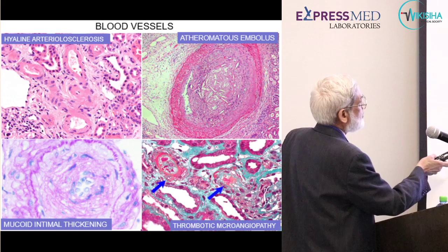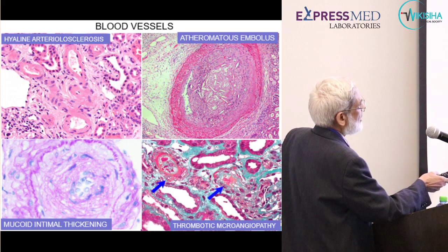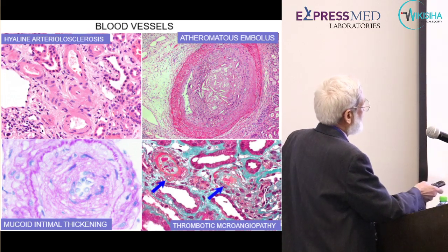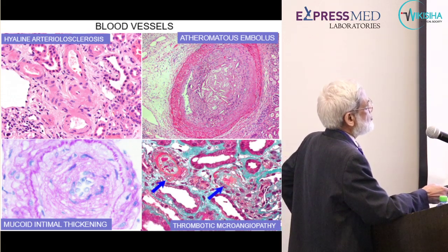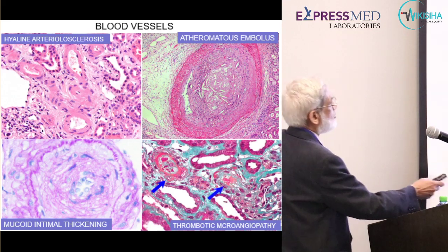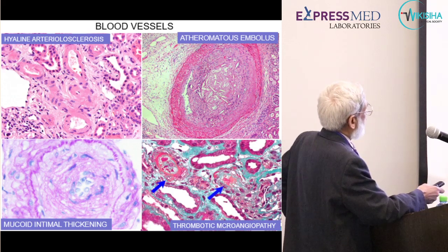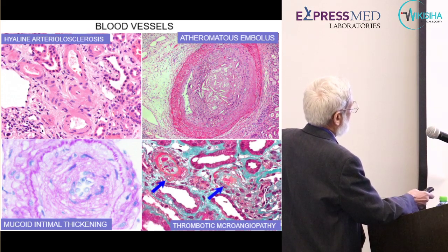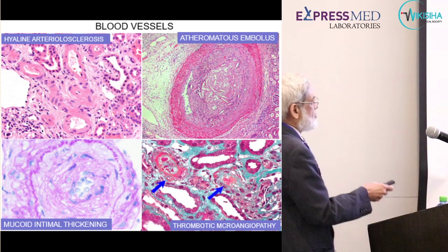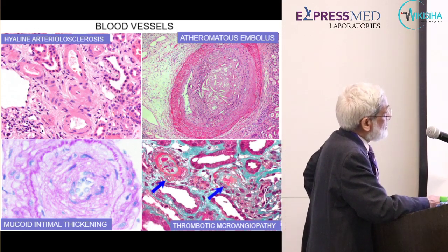You can see a thrombus, or embolus causing complete obstruction of the lumen here, identified by the presence of cholesterol clefts. This may be the only lesion causing renal failure, usually associated with severe lower aortic atheromatous lesion. This is a mucoid intimal thickening. The intima is from here to here, that's the media, the small artery. Instead of fibrosis, you are finding this loose edematous tissue. Mucoid intimal thickening is a special feature of diseases like antiphospholipid syndrome. So important lesion to identify.